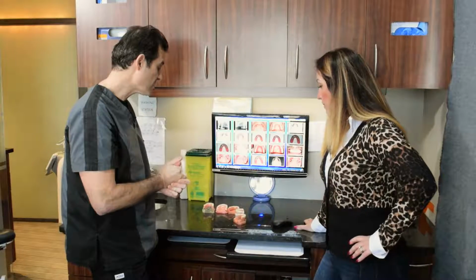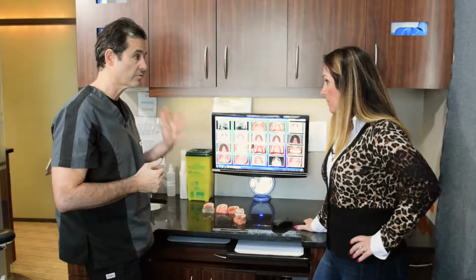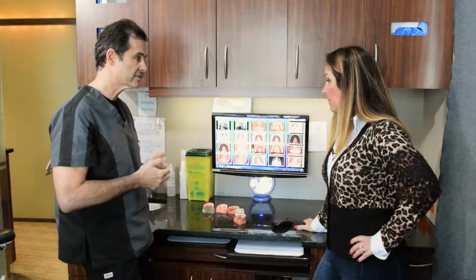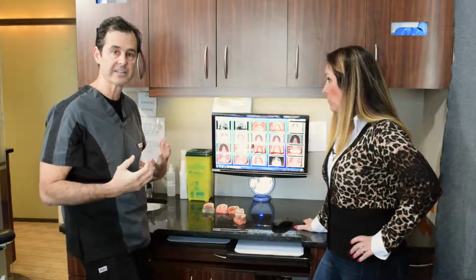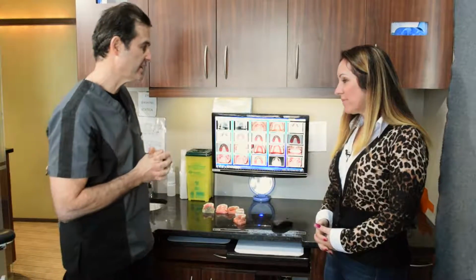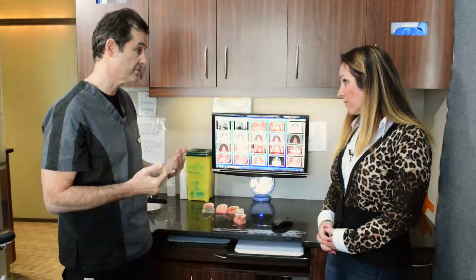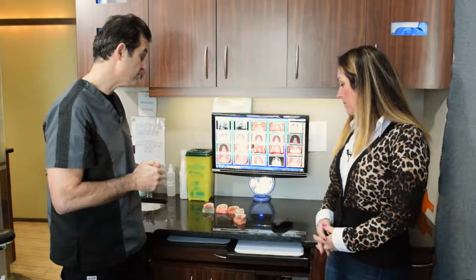So there are options where we can do fixed teeth, and there's two options for what the teeth are made of. When we start talking about fixed teeth, we're talking about something that's not removable at all. So it's screwed into place. The patient cannot remove it. The dentist can, sometimes. It depends on how we've constructed it. Okay. Sometimes they're retrievable, then they're removable, and sometimes they're not. And so these are wonderful options.